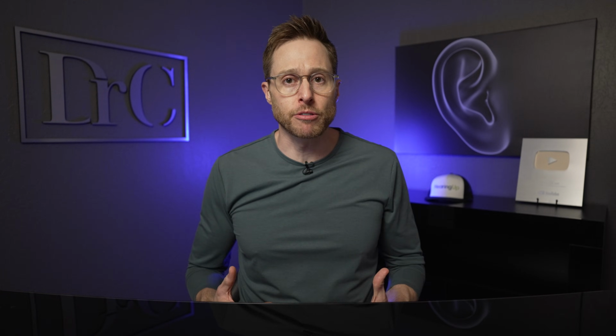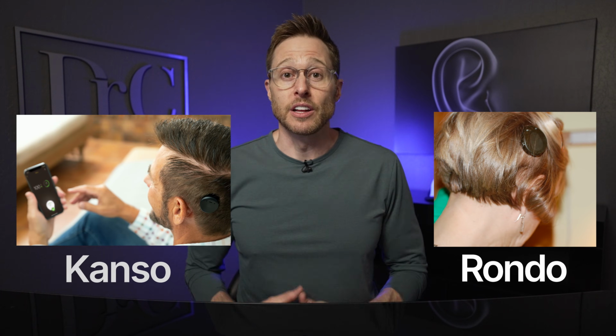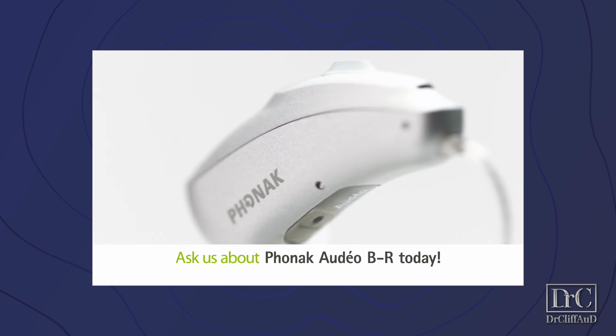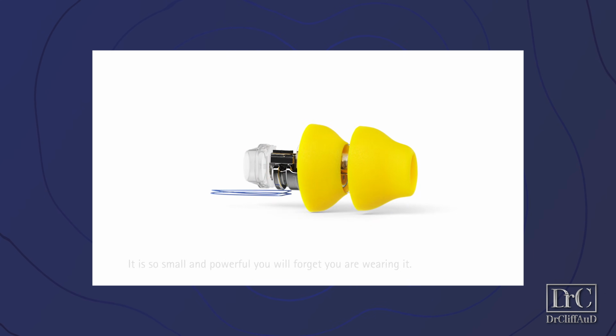Now, things have changed a lot with these cochlear implant processors over the past decade or so. You no longer have to wear a processor that goes on top of your ear. You can get an off-the-ear processor like the Rondo or the Kanso. And some people just do not want their processor to be seen. And even though hearing aids have gotten so small over the past several years, to the point where really no one knows that you're wearing them, cochlear implants just aren't quite there yet. And this is what makes a fully implantable, 100% invisible cochlear implant so exciting.